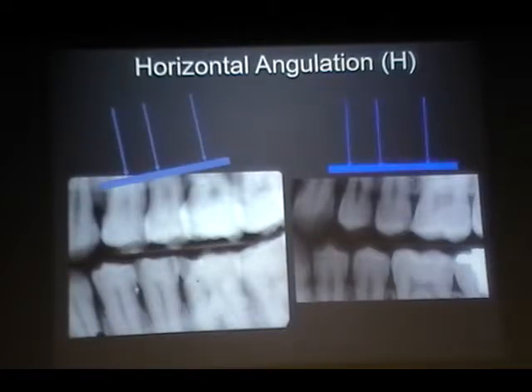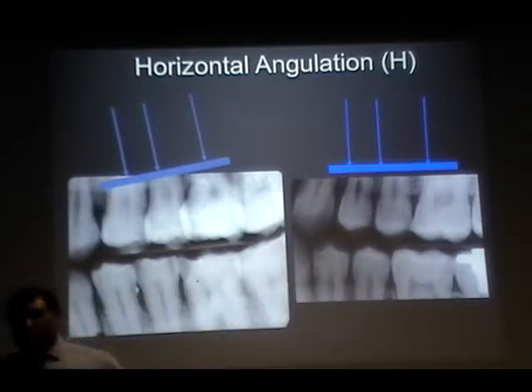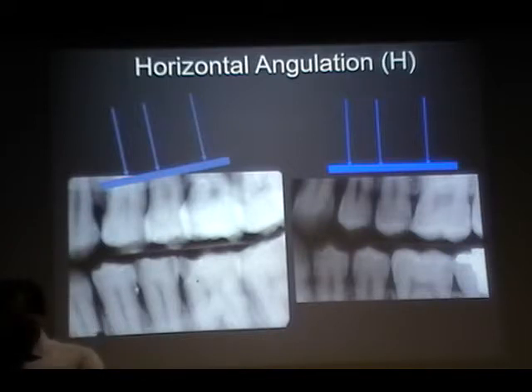Wait, to follow up on that question, you said you have to make sure you capture the different parts in different views. Do you retake the same one and get open contacts once at the distal another time, or move on to the next? Move on to the next one, because most of the time, getting a full mouth series is the easiest job. You could finish in 20 minutes. So, to answer your question, yes, move on, don't just hang up on one particular view or projection.